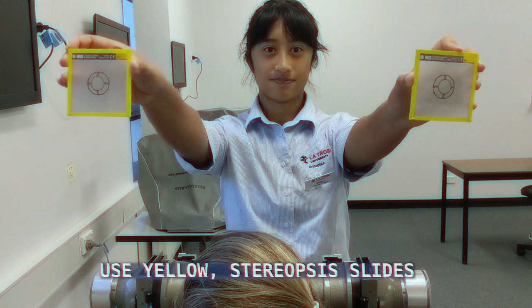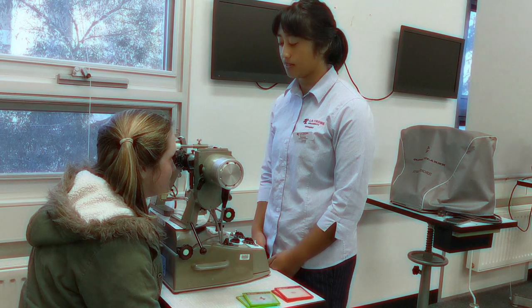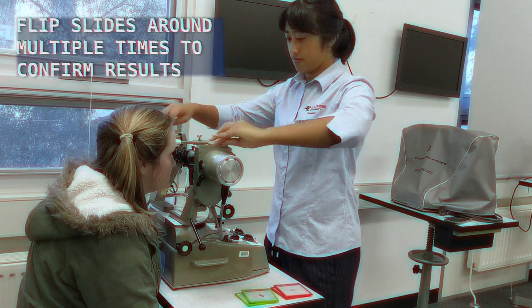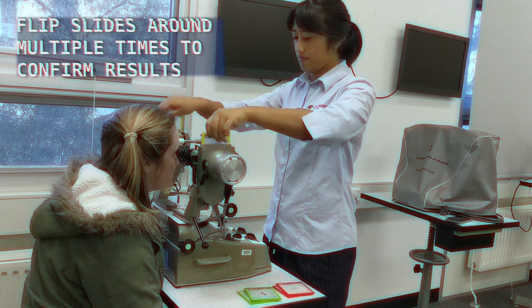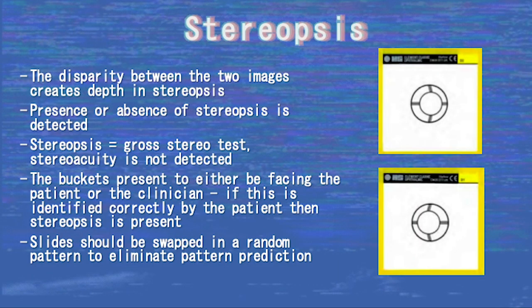The disparity in the bucket slides creates depth and stereopsis. The clinician asks the patient if they can see the bucket and whether the base is facing towards the clinician or towards the patient. In stereopsis, the pair of images are the same but there is some disparity which creates depth. Stereopsis here is a gross stereo test and stereoacuity is not detected — it simply detects either the presence or absence of stereopsis. The buckets present as either facing the patient or the clinician, and if this is identified correctly by the patient, stereopsis is present. Slides should be swapped in a random pattern to eliminate patient pattern prediction.